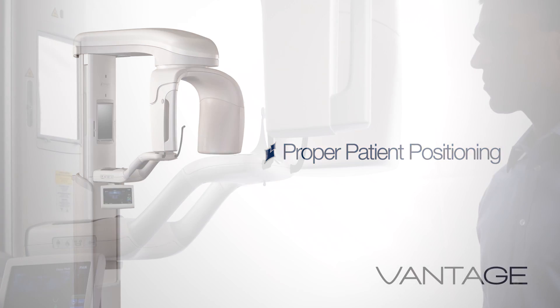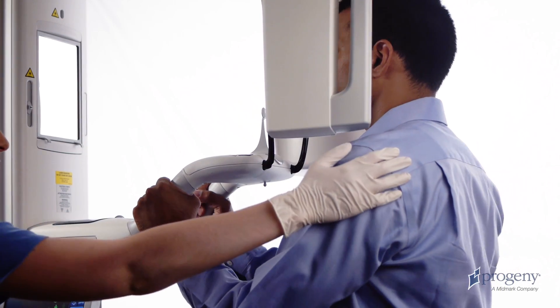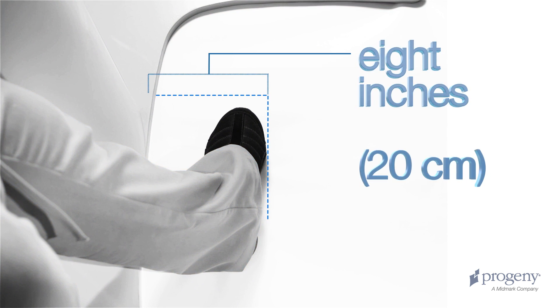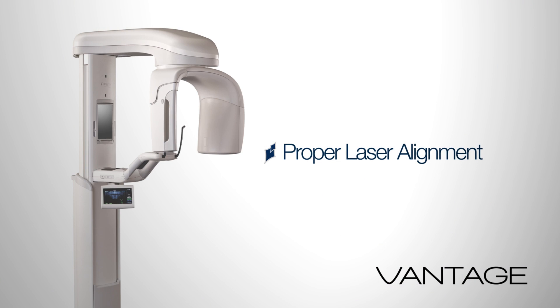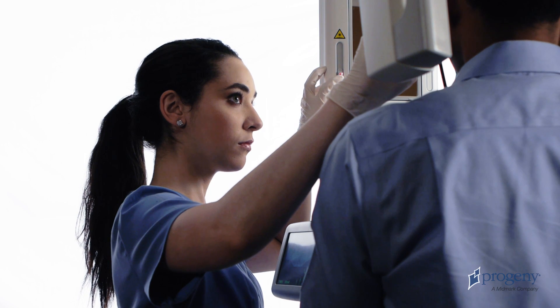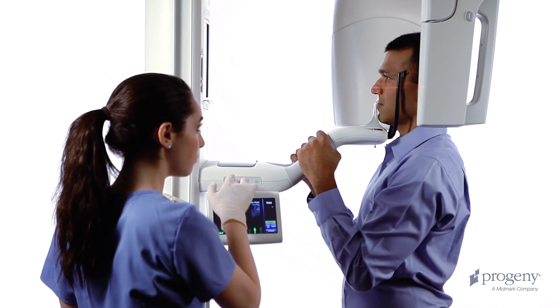Begin patient positioning. Instruct the patient to place their hands on the stabilizing grips. Gently guide the patient towards the vertical column. Instruct the patient to bring the toes in contact with your instep, which will be placed approximately 8 inches in front of the vertical column. Ask the patient to stand at full height and relax the shoulders. Adjust the Frankfurt plane laser to align with the base of the patient's orbit and the top of the ear canal. Use the height of the positioning table to tilt the patient's chin higher or lower to bring the Frankfurt plane horizontal.